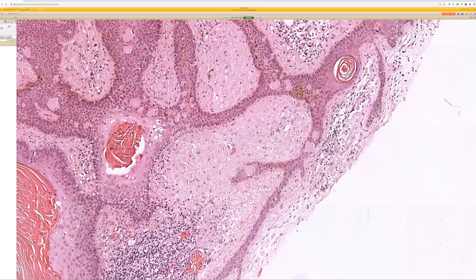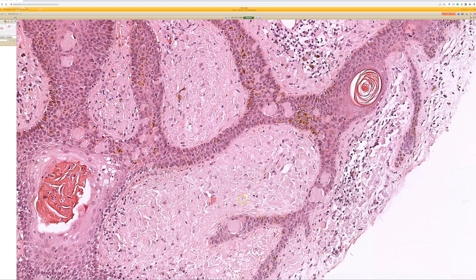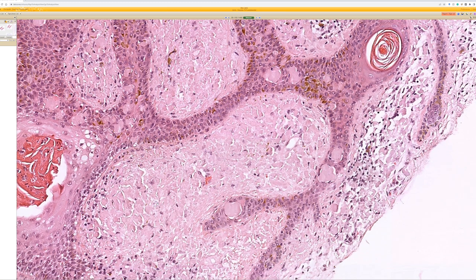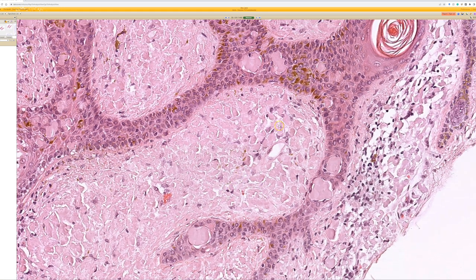If we look at the pale pink areas, we see some scattered deposition of pigment, and then we also see these pink amorphous little balls that could be keratin-derived amyloid with the cracking that we see. Exactly — this is pink keratin-derived amyloid filling the papillary dermis, just like in the case of macular amyloid we saw earlier. It's the same exact process, just occurring in association with this seborrheic keratosis: pink amorphous deposits with cracks in between them and trapped melanin pigment.